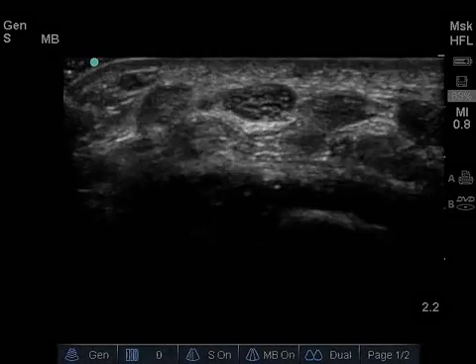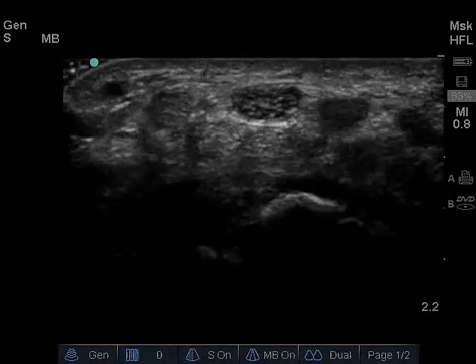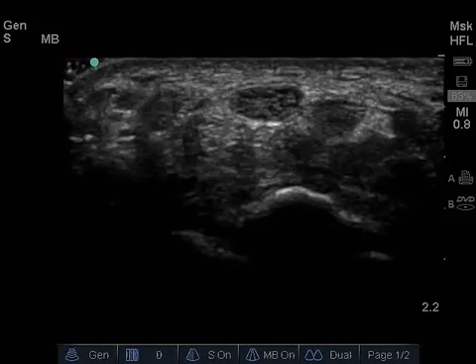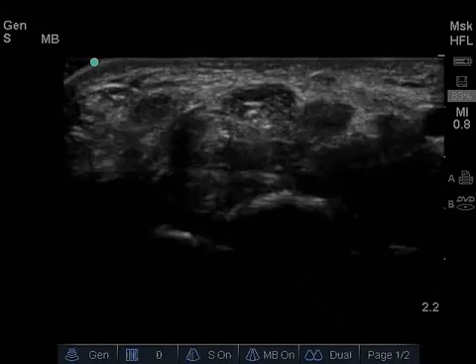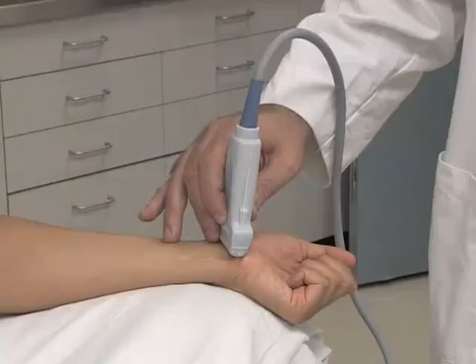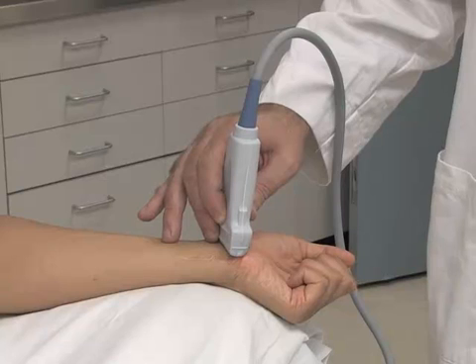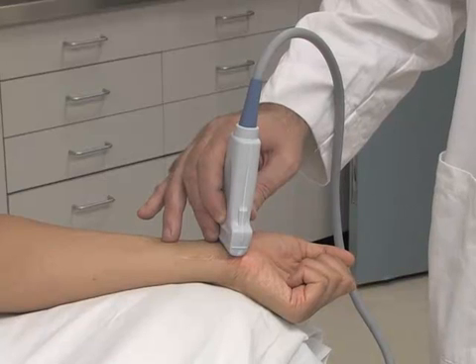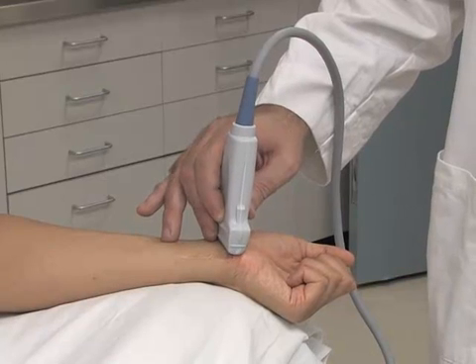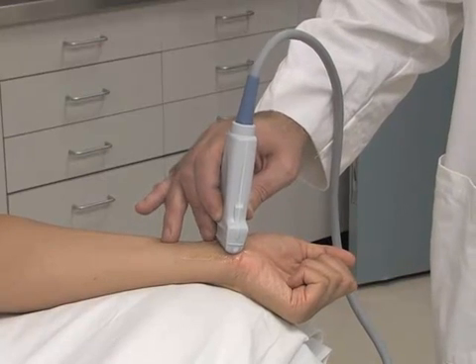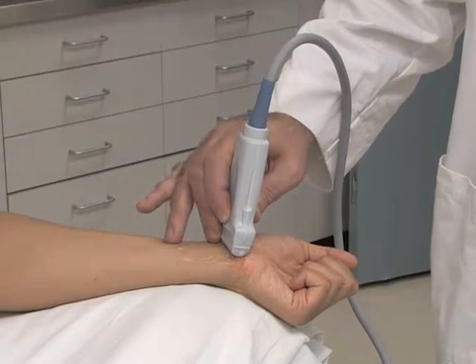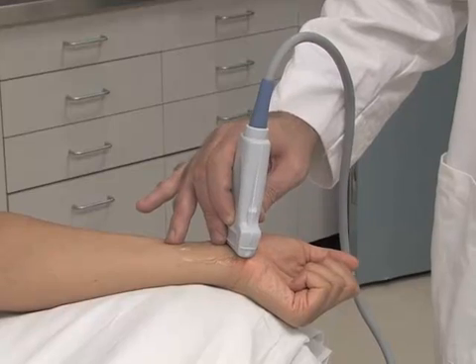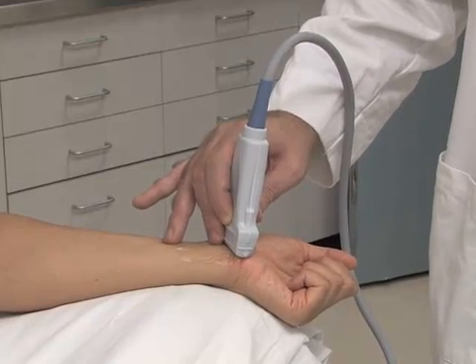Welcome to Mobile Medical Media's video review of ultrasound examination of the carpal tunnel. This module reviews how to use ultrasound to identify carpal tunnel syndrome during evaluation of the volar surface of the wrist.